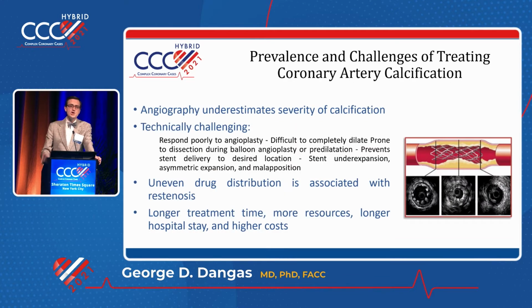However, what doesn't change, and no matter how many times you show this slide it never gets old, is a fundamental reason why an angioplasty may have some problems. And we saw in the very last case, if you look at this graph, this is exactly what Dr. Kinney tried to avoid: the left part of this stent right here, that was a proximal part, and that was really big. And she really wanted to be able to expand the stent without being impeded by this calcification. It was really a ridge right after this diagonal we saw. So you can see how this stent could be malapposed.